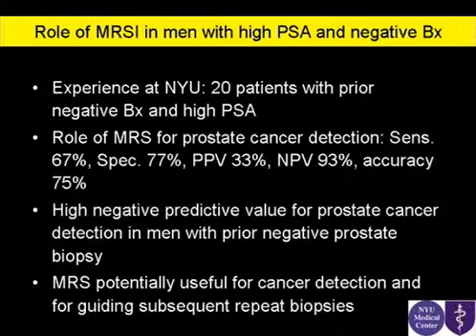So in about 20 patients, we diagnosed 2 or 3 cancers which were completely undiagnosed by biopsies, which is extremely interesting. But at the same time, we also had 2 or 3 false positive cases, especially in the central gland. So we think that spectroscopy is potentially very useful in this patient population.